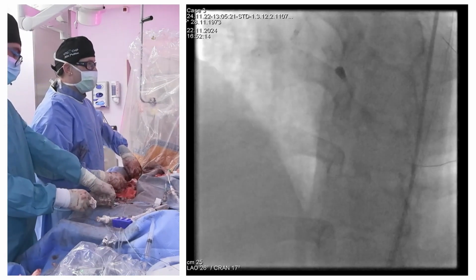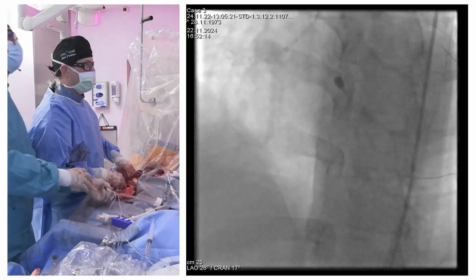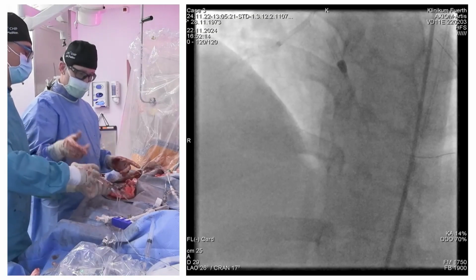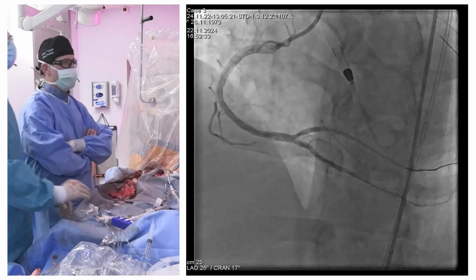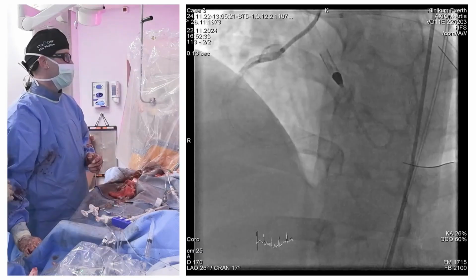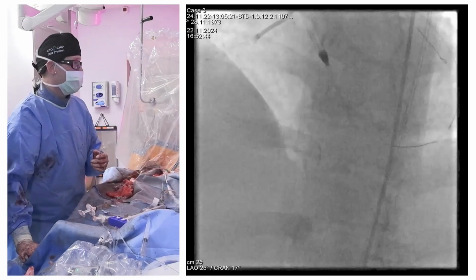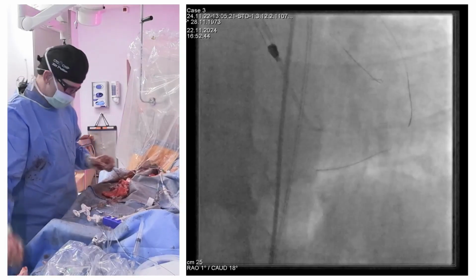A lot of the stent failures in the studies, I mean, because there is no strict protocol on how to do PCI. Because, you know, some people do this first, this next. Some people have achieved a good lumen before they implant a stent, before they implant a drug-eluting balloon. And this, I think, is the cause of the problem, why we have very different results in TLR in different centers if we look at one study.